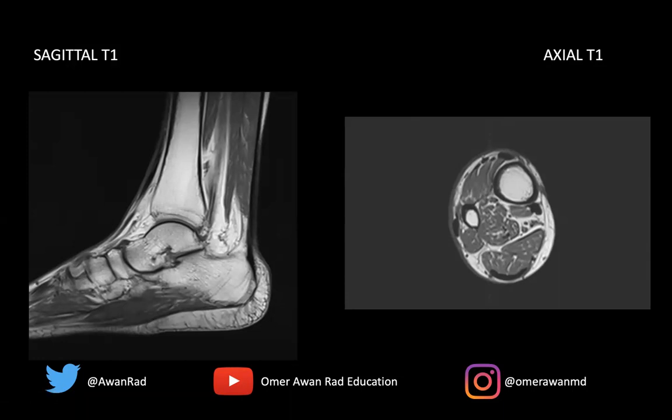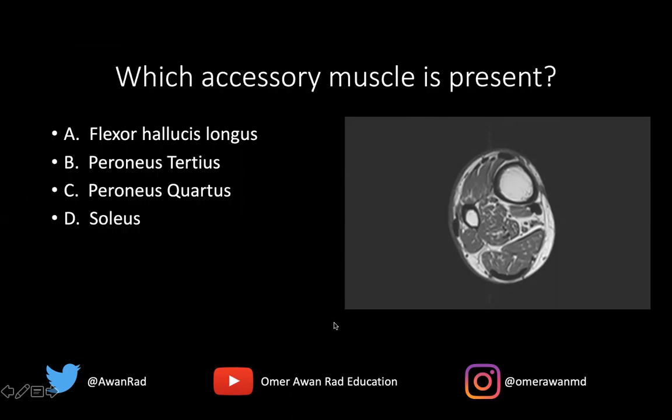Hello everyone, and welcome to MSK Unknown Case Series, Case 39. Today we have a sagittal T1-weighted image through the ankle and an axial T1-weighted image through the ankle. Upon first glance, we don't see any major abnormality. But the question I want to pose to all of you is: what accessory muscle is present here?